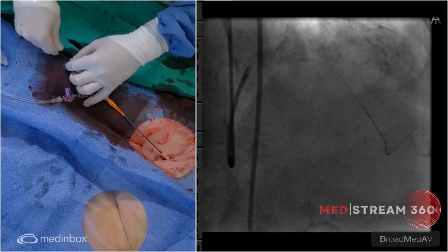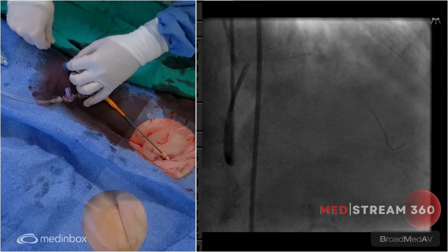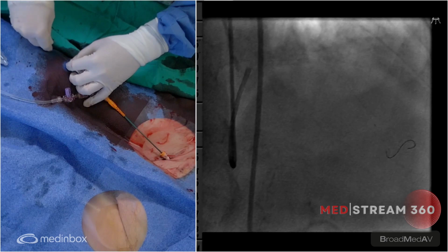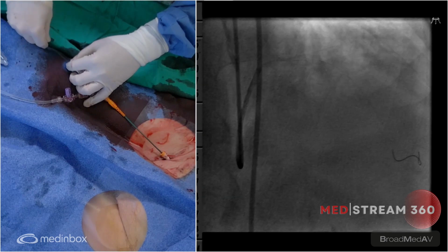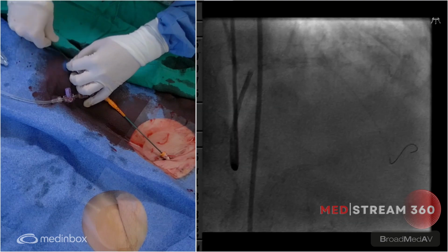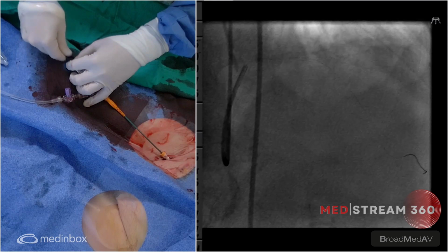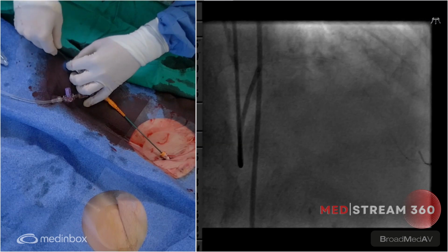You're on the right trajectory. There we go. I think that should be good enough. You'll loop it down. The reason I want to make sure we get it as deep as possible, I'm thinking once we are in with our rotowire, I want to bury it deep. So perfect.